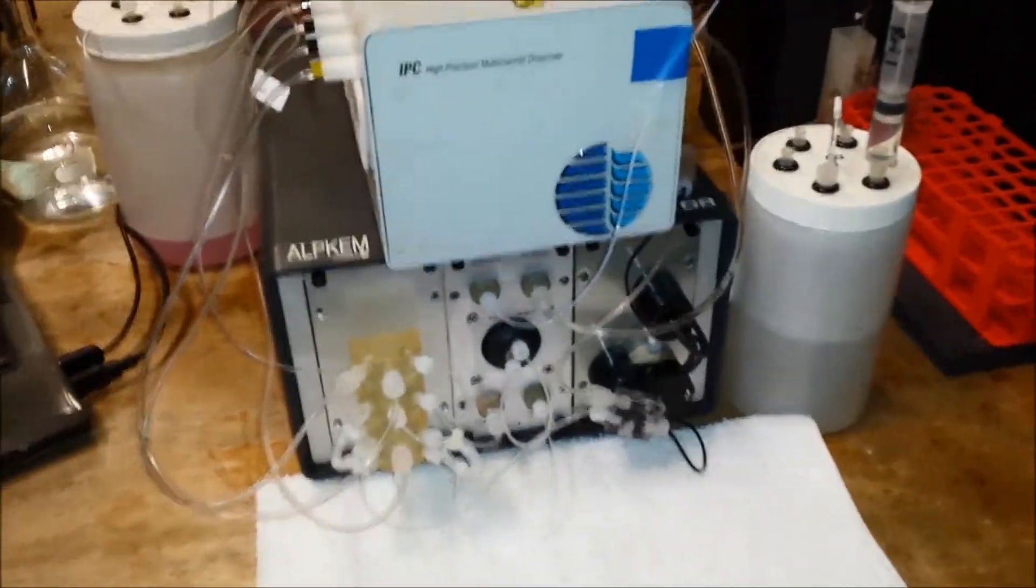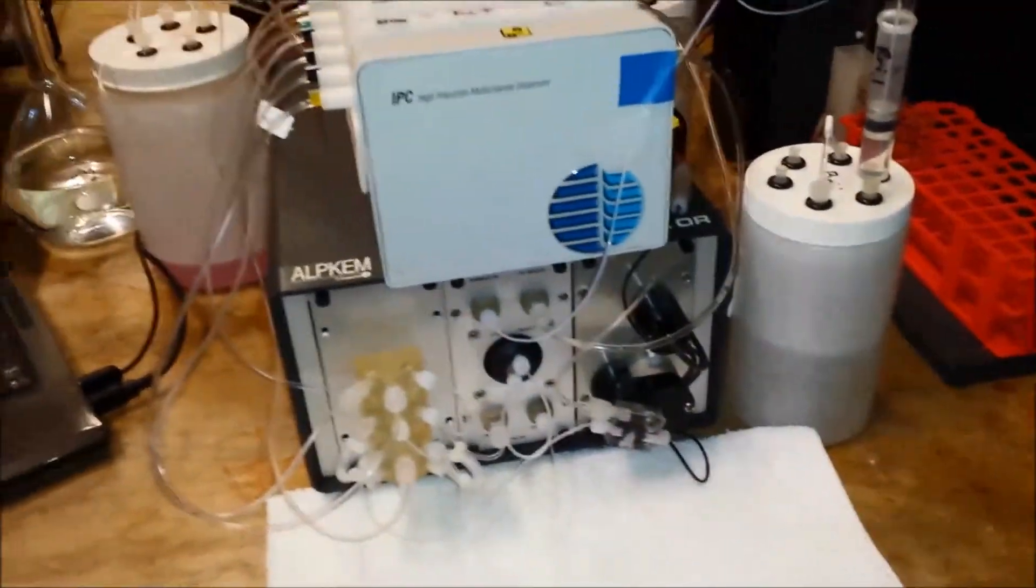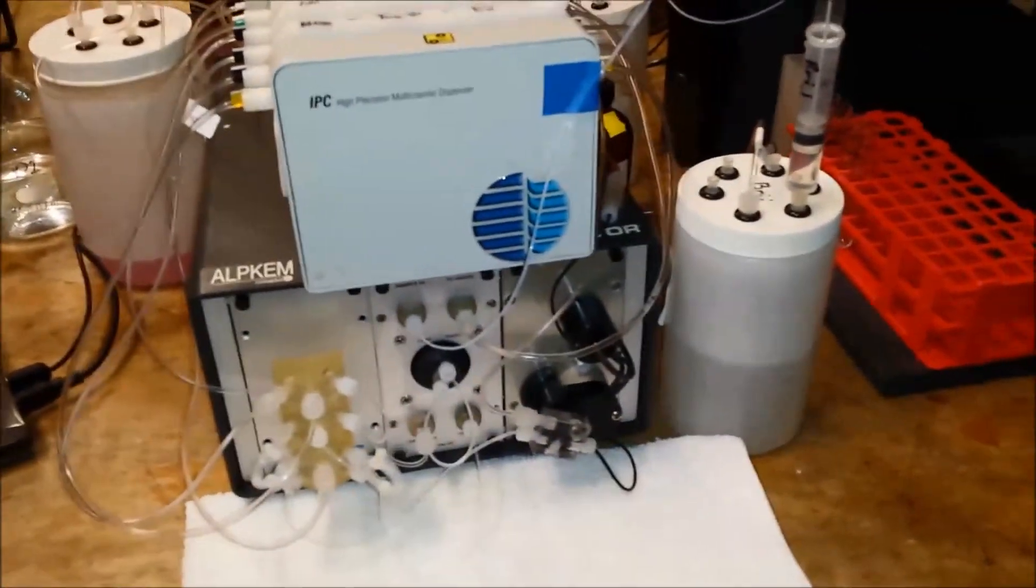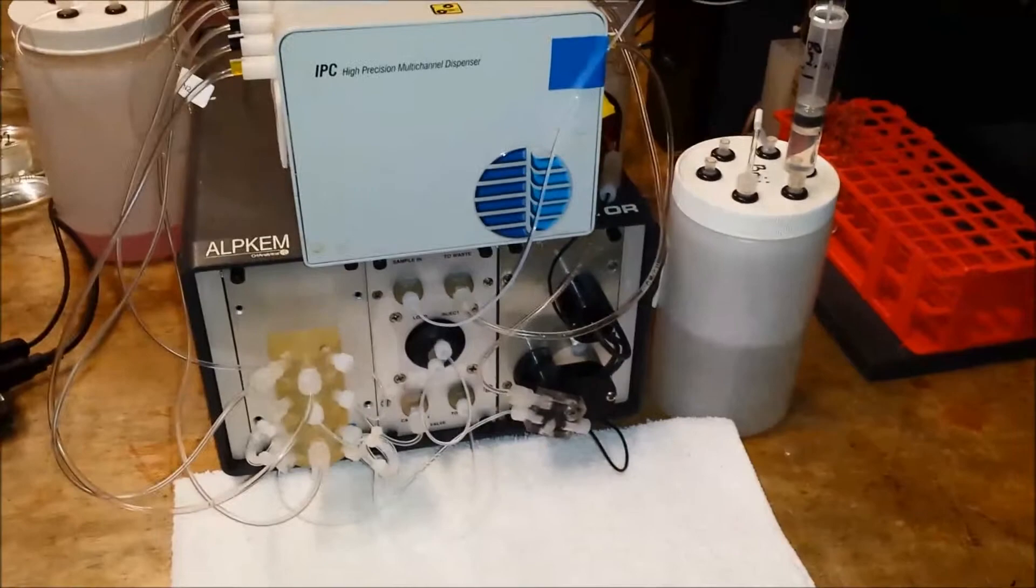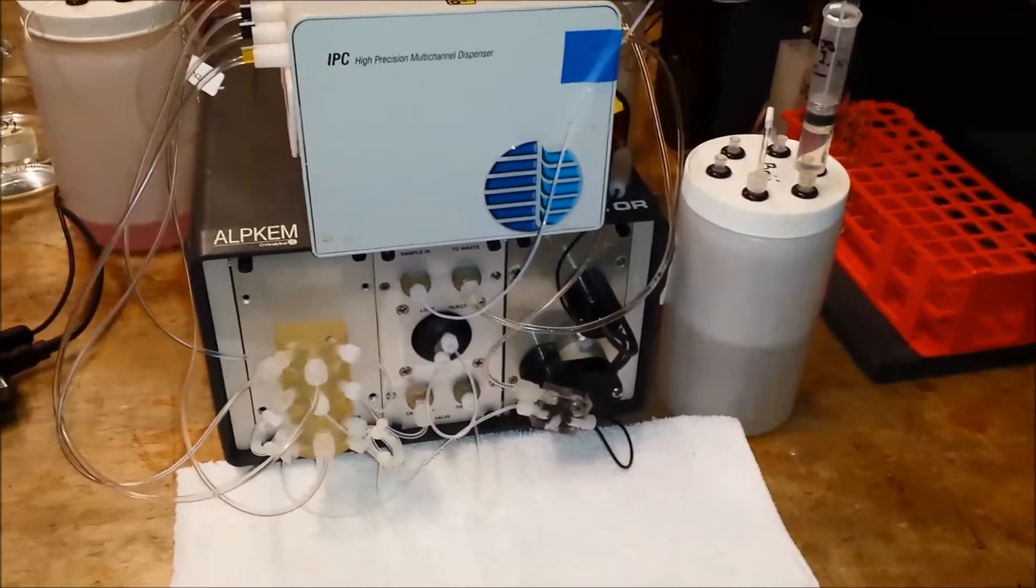In this ongoing video series of troubleshooting auto-sampler problems, we're looking at clearing a flow cell.